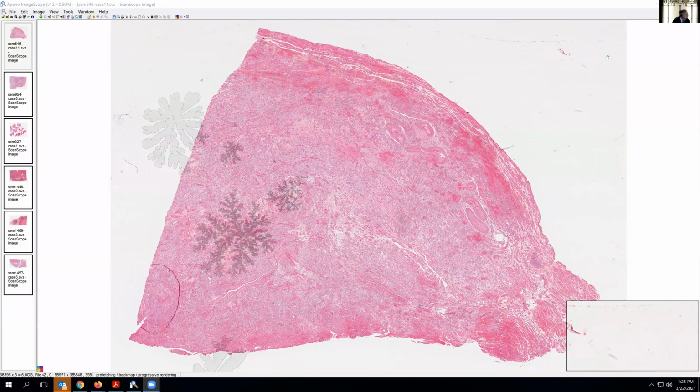So we'll pause here for just a second. And so here's a nice example of this lesion. I've got a couple of digital slides, and these links to these slides, which are not from Past Presenter, will be available in the comments.